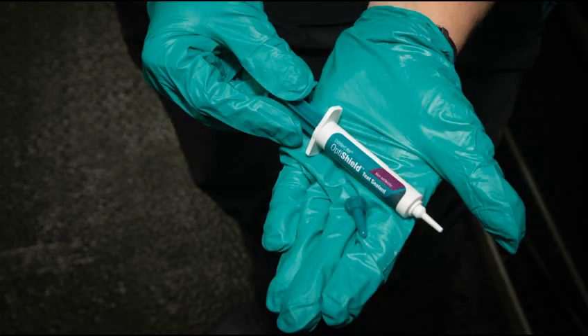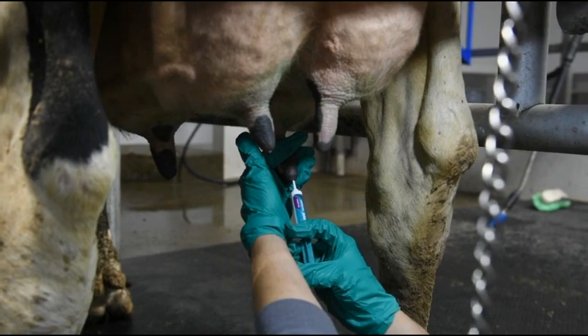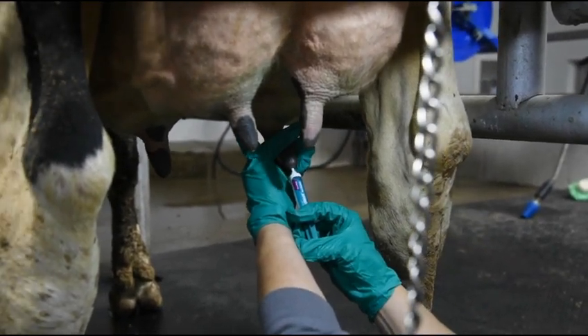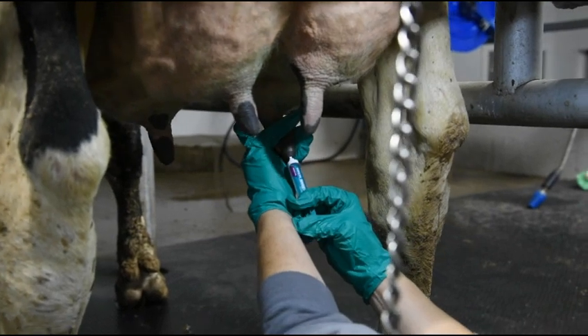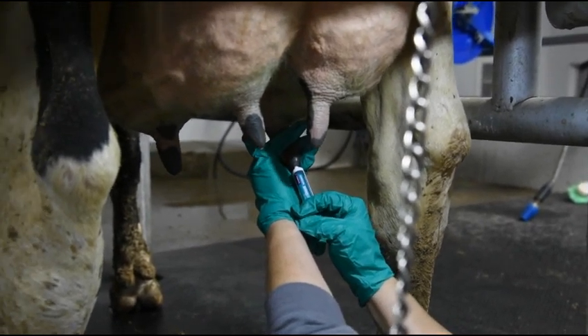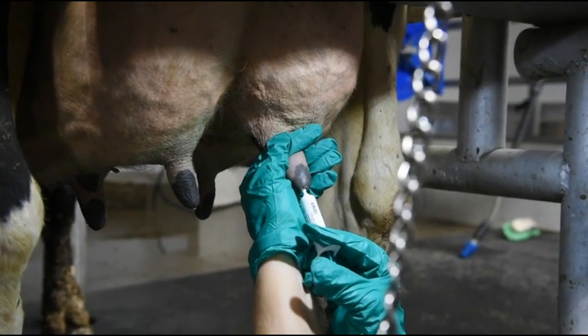First, remove the cap of one syringe of UdderLife OptiShield. Squeeze the teat canal at the base of the udder and insert the tip of the syringe — the tip should be placed just into the streak canal. Be careful not to insert it too deeply. Depress the plunger until the teat canal is full. Repeat the same procedure on the remaining teats.